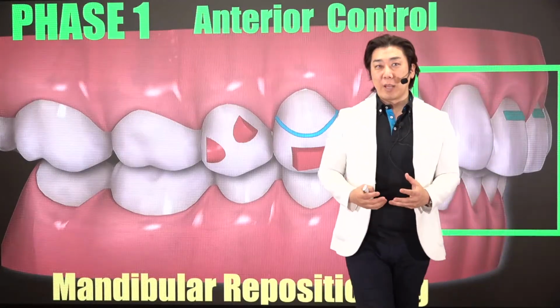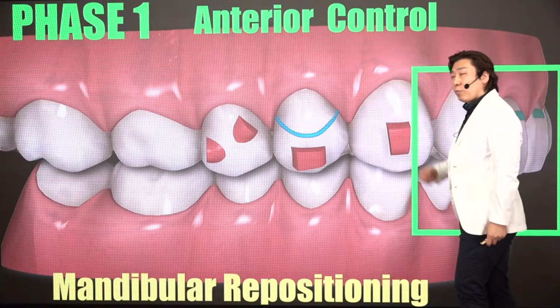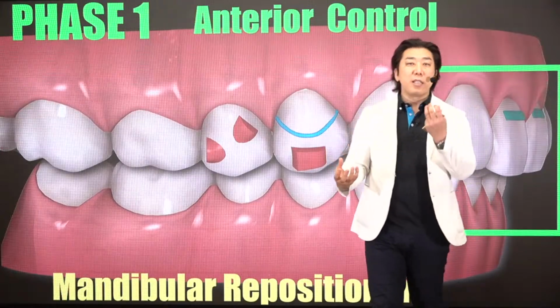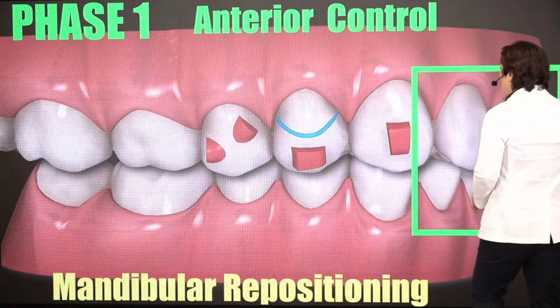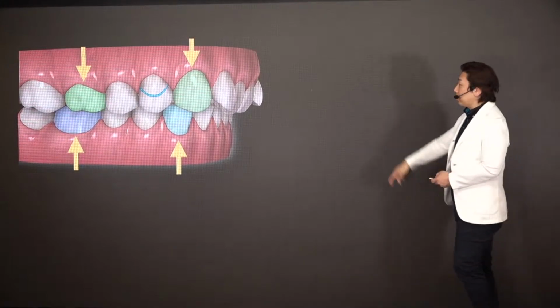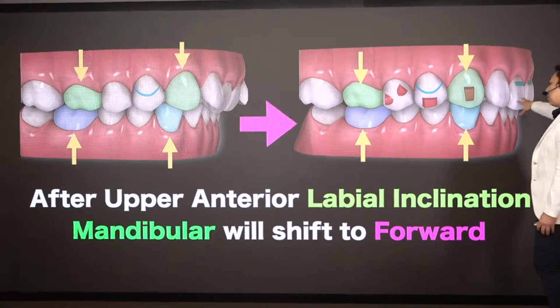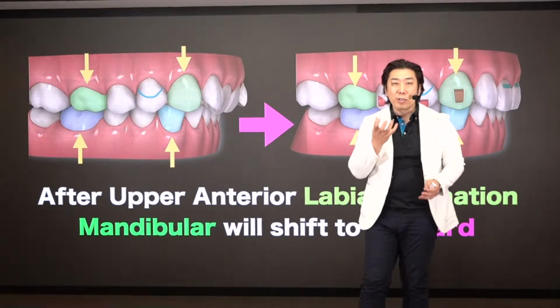This is an image. Okay? This is the same as a bracket system, same as regular braces. So we have to imagine it. If you plan the molar movement fast, or if you plan the anterior teeth to move fast, how will your patient react, the mandible, the joint, everything? After that, focus on tooth movement. Okay? Initially, like this, canine, first molar, definitely a class 2 situation. This is the class 2 situation. With upper anterior labial inclination, the mandible will shift forward. This is not tooth movement. The patient's mandible just naturally goes forward.